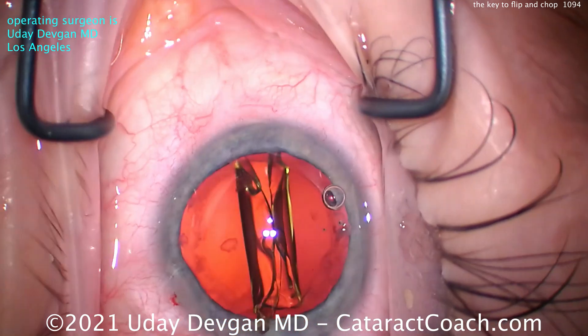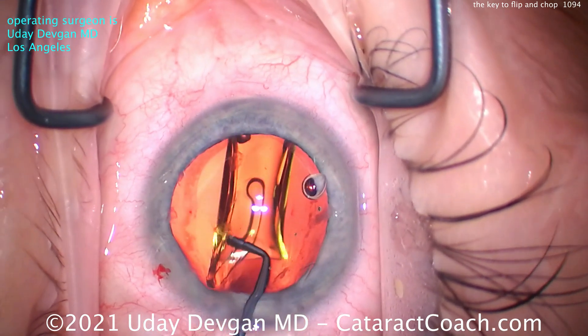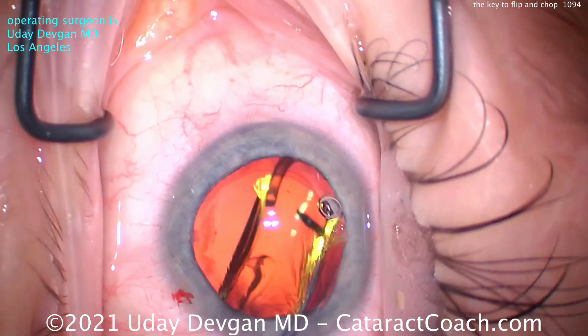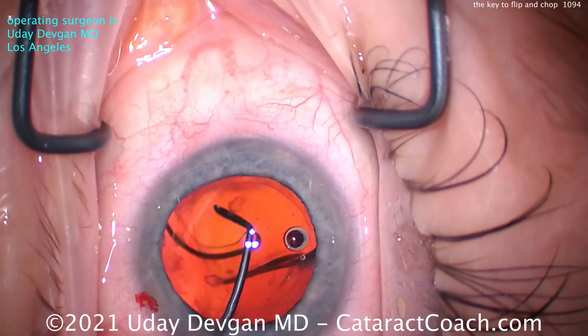Delivering the lens — here it goes, into the capsular bag, nice and easy. Good job by my technician loading the lens. Let's put it in the capsular bag completely and get this positioned. We're going to finish up the case here.